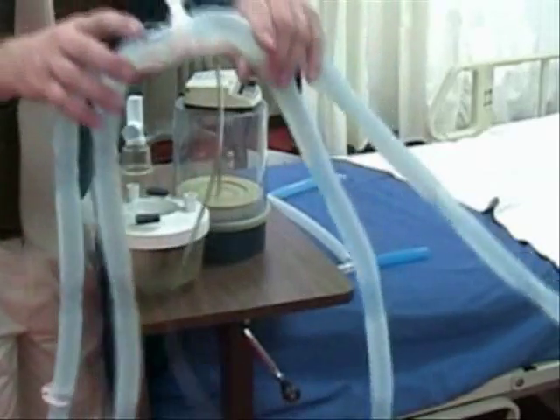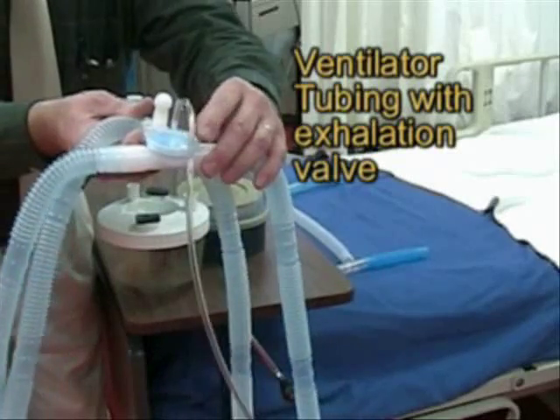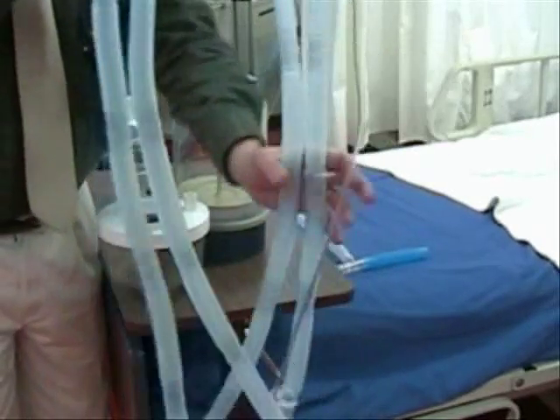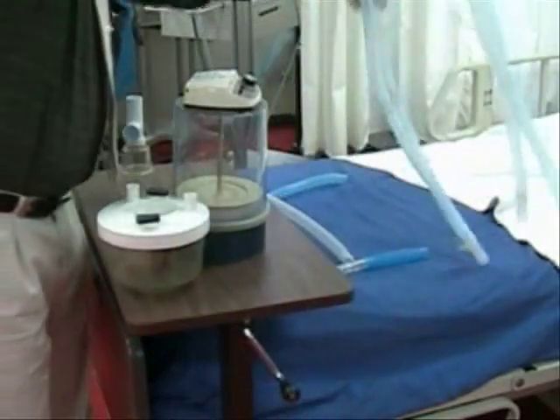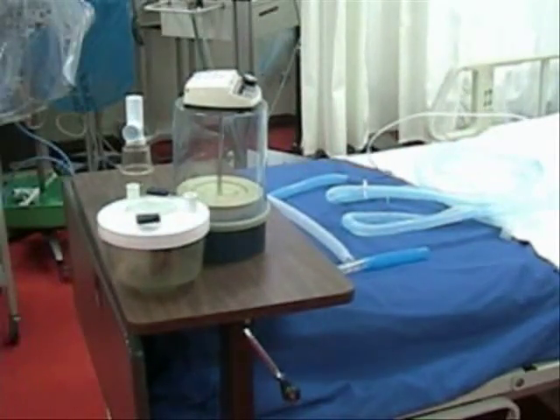The ventilator tubing needs to have an exhalation valve built into it, and this is an entirely disposable circuit. So let's assemble this ventilator in a step-by-step process.